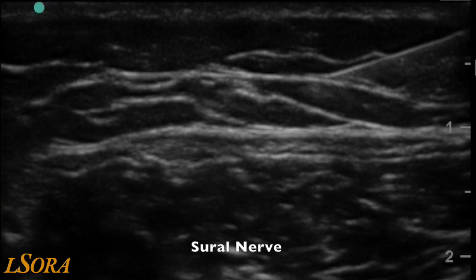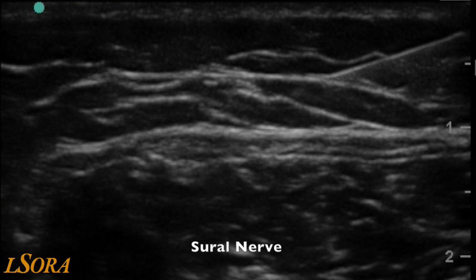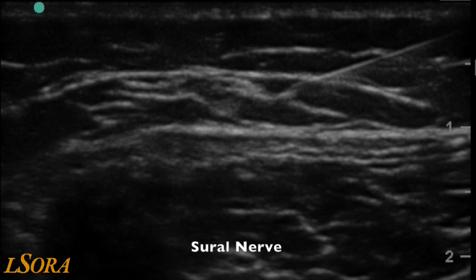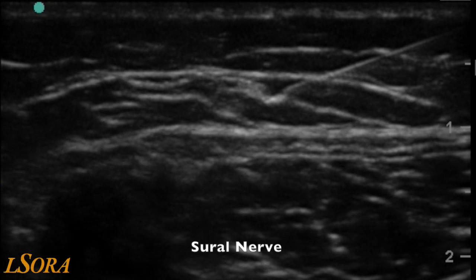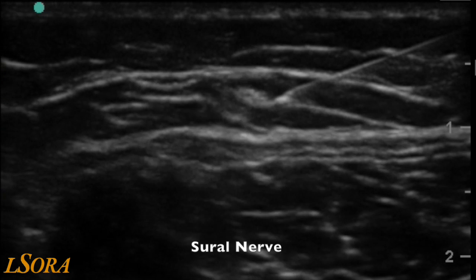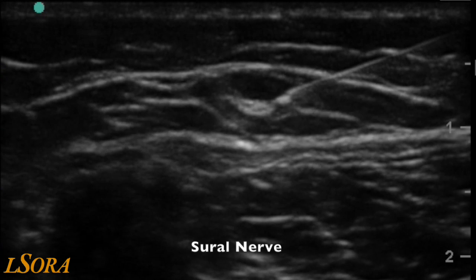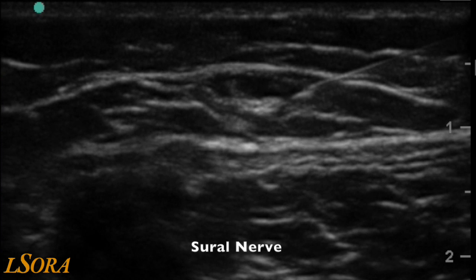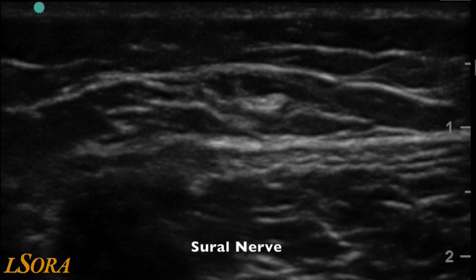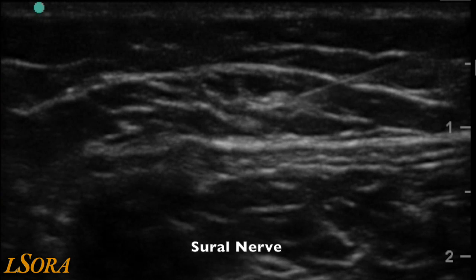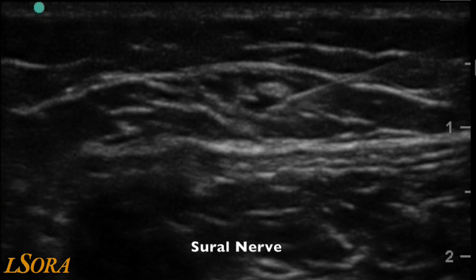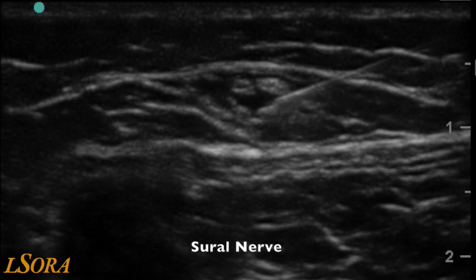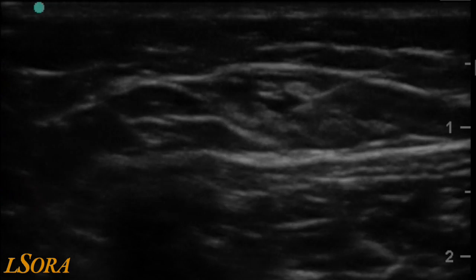In this sural nerve block, the needle is introduced in-plane from an anterior to posterior direction. Care must be taken not to obliterate the small saphenous vein with too much probe pressure. As local anaesthetic is injected, the hyperechoic sural nerve becomes highlighted.